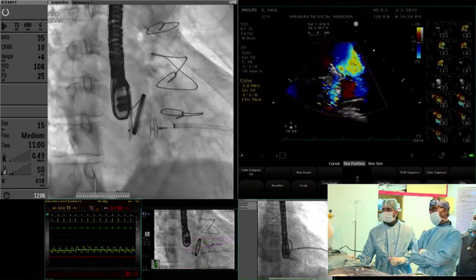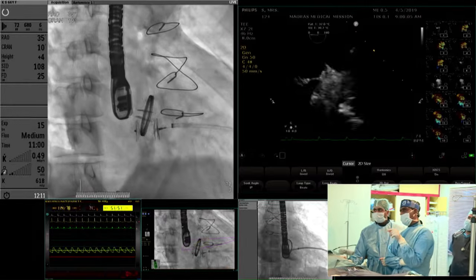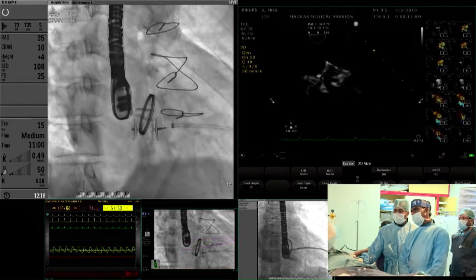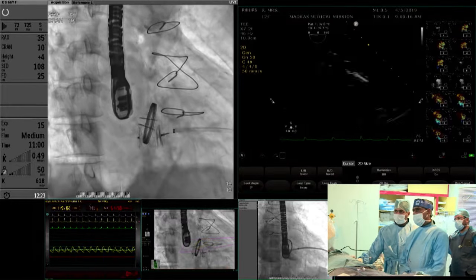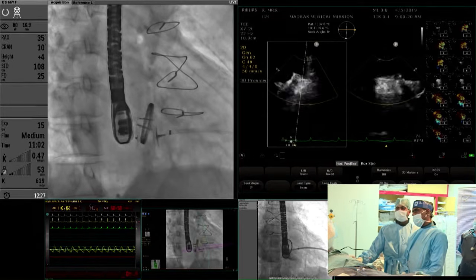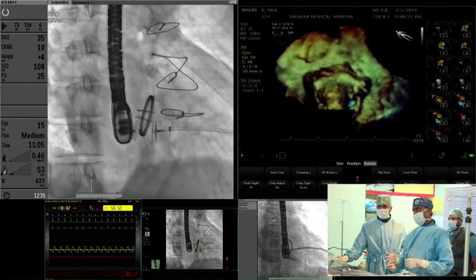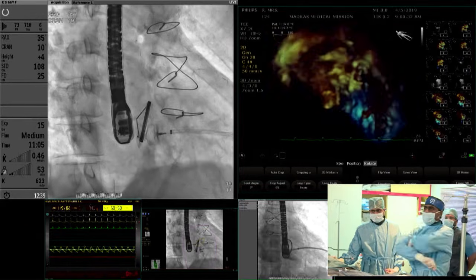See, what was happening, Dr. Raj, is that when I release the middle part of the disc in the center of the leak, it is getting milked towards the left atrium. So then I will have only one disc on the left ventricular side, which is the forcing side. So now what I have done is I have pulled the central belly also into the leak, into the left ventricle. Can you see that? Yes. The original intention was to get the middle of the belly. Show the previous picture.